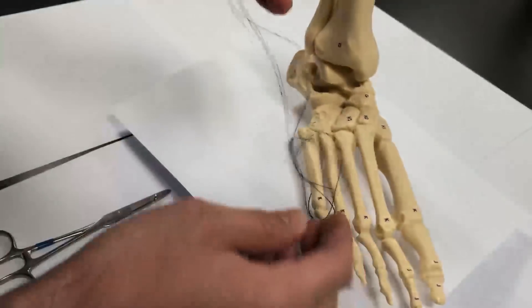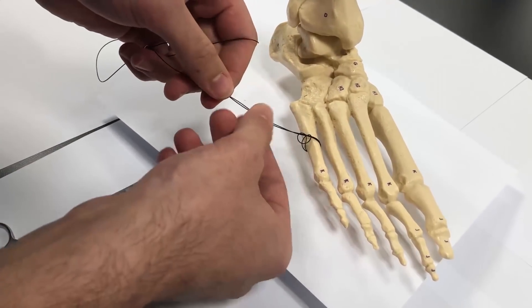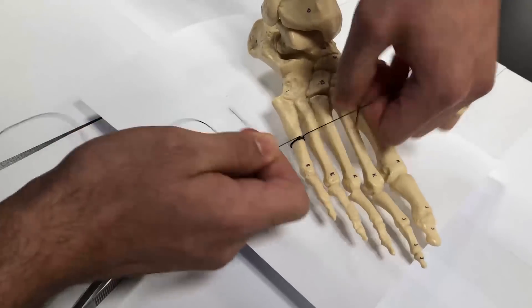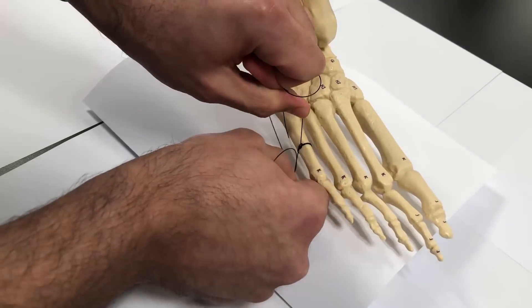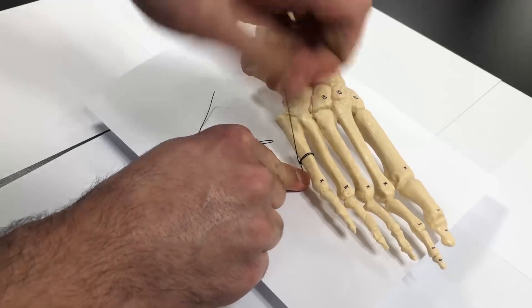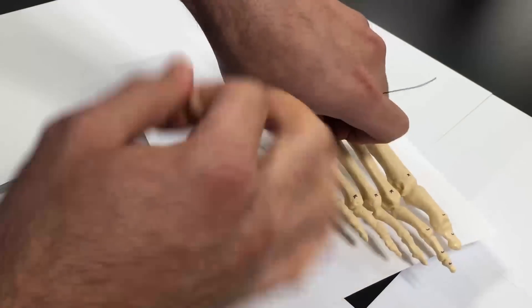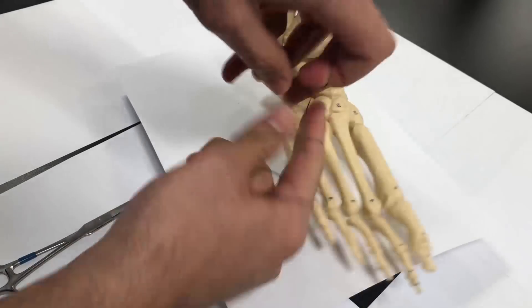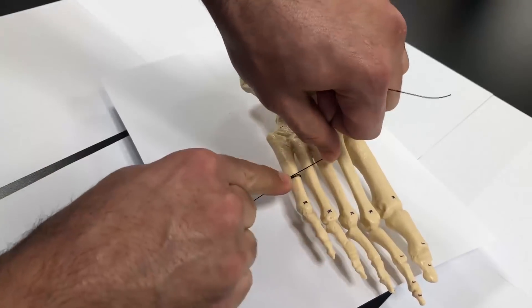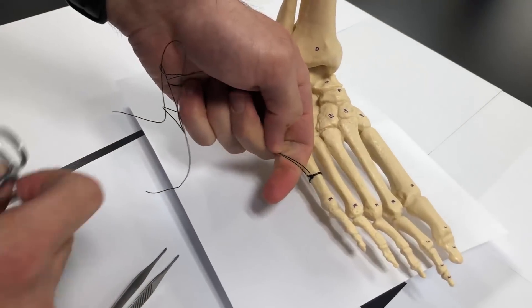Once you've done that, you pull everything through. Make sure to align your loop, your cerclage right at the fracture site. Take the two ends, pull them apart, and cinch it together until you get the adequate tightness and adequate reduction. Once it's tightened, you can throw some hand ties to reinforce. Two or three ties will be adequate to hold down your knot. After you've done that, you can cut your knot short.